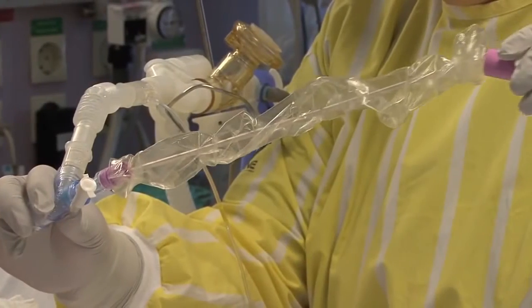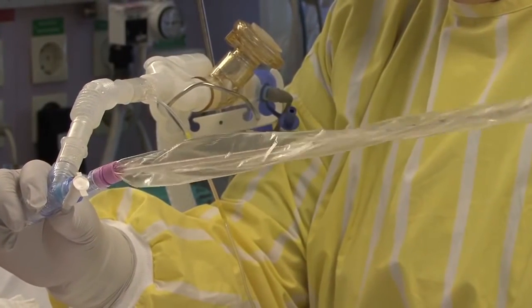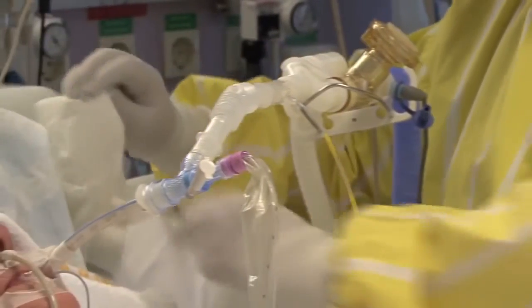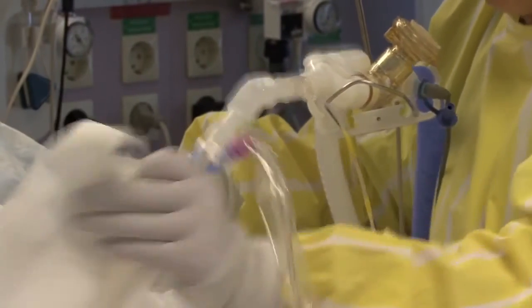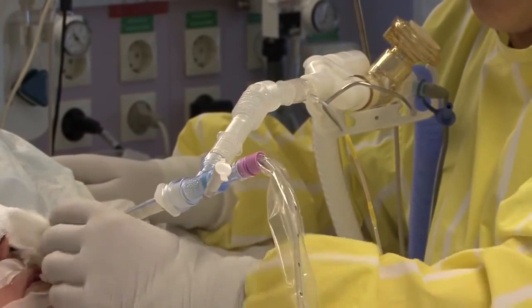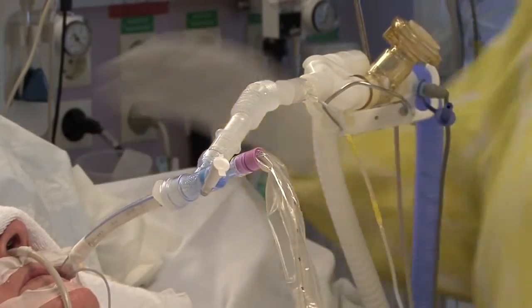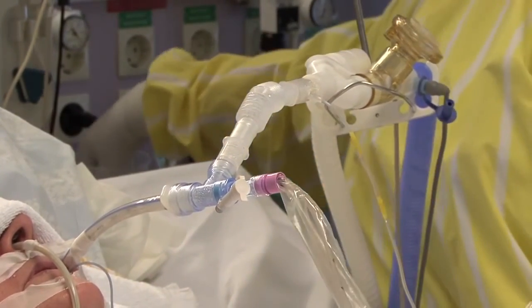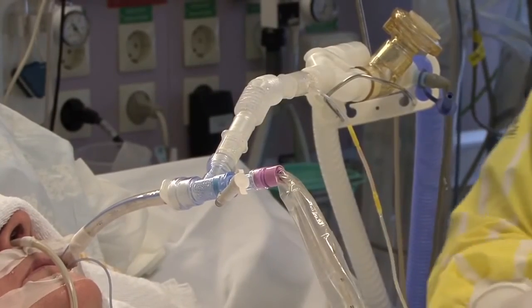The catheter must be fully withdrawn to ensure that it is not extended into the airway even slightly. If the catheter is left within the lumen of the airway, increased airway pressure may result. Additionally, the catheter may impede any aerosol medication delivery by acting as a baffle, causing aerosol particles to collect on the catheter rather than travelling down the ET tube.